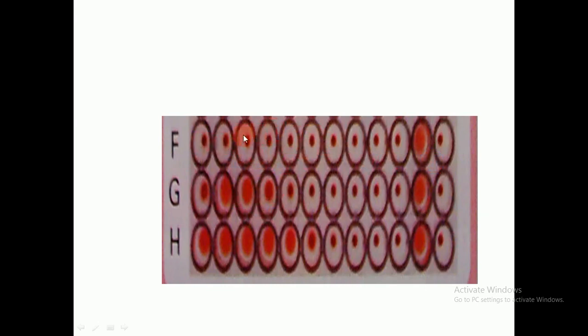Here the patient is infected because the patient forms antibodies, and here not infected because the patient does not form antibodies.